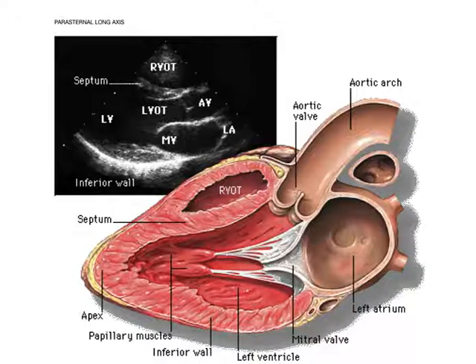And what you see when you do that is very superficially here, very anteriorly, we see the right ventricle. Okay, so the right ventricle, it's amazing how close it is to the skin line, and how that's a little chink in our armor as human beings, where if we had somebody stab us there, or maybe it was a stingray that we're swimming with could get us there in that sort of parasternal fourth, fifth intercostal space, that's where you put the probe in order to see the heart, because it comes so close to the chest wall.